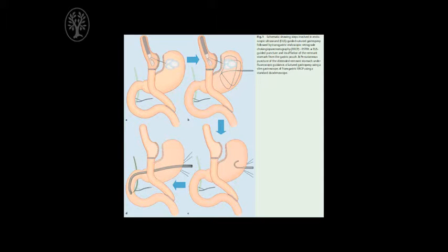In our study, we have presented data from 10 post Roux-en-Y gastric bypass patients who underwent ESTER between July 2009 and September 2014. Access to the bypass stomach was successful in all 10 patients. A secure gastrostomy using sutured gastropexy was created in 9 of the 10 patients. ERCP was successful in 9 of these 10 patients.